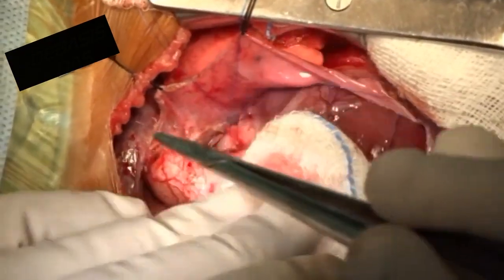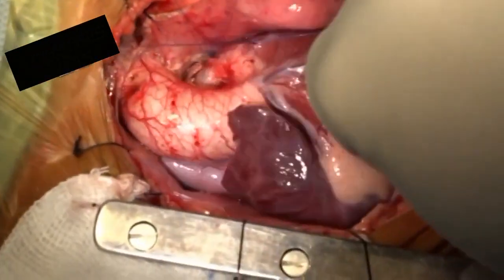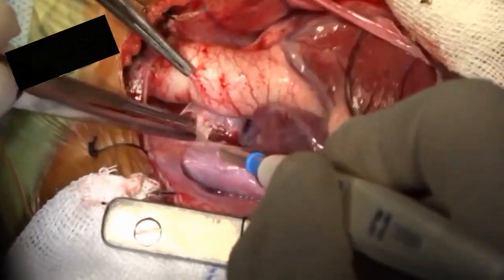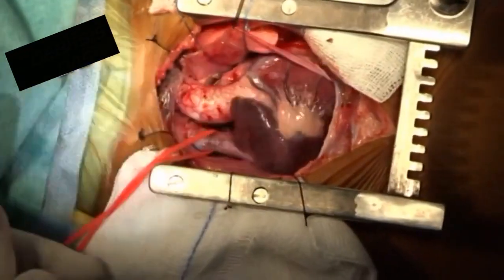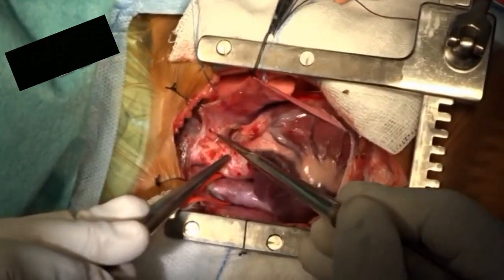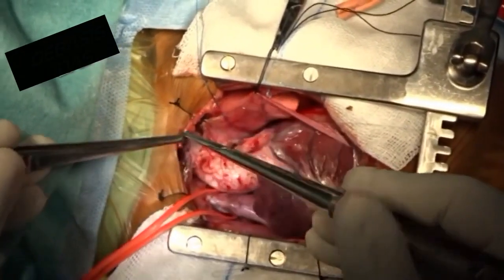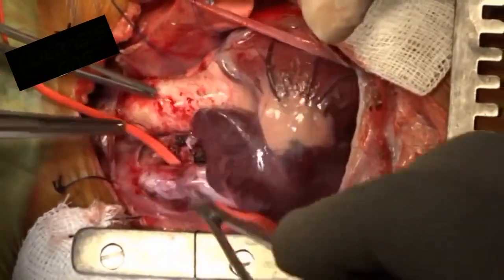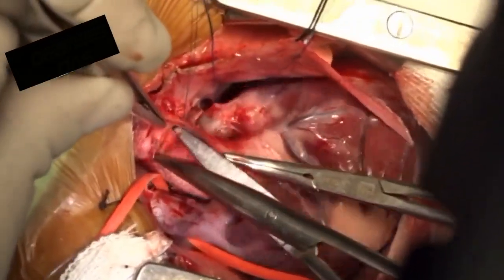Stay sutures are taken on the main pulmonary artery and also on the ventricle for marking as well as future ventriculotomy. The SVC is mobilized, a snare is passed, and purse string sutures are taken on the aorta and then on the superior vena cava for cannulation.